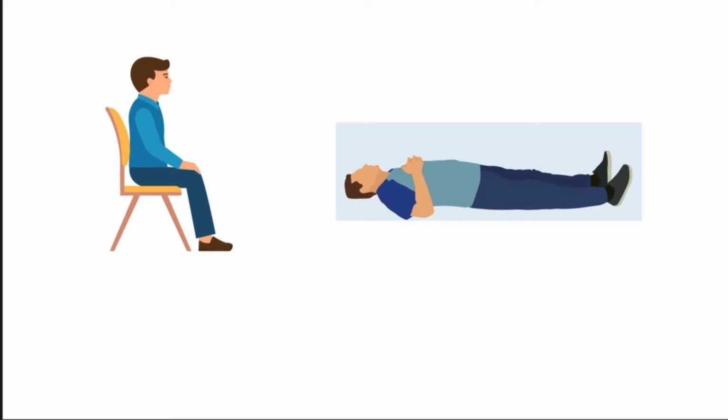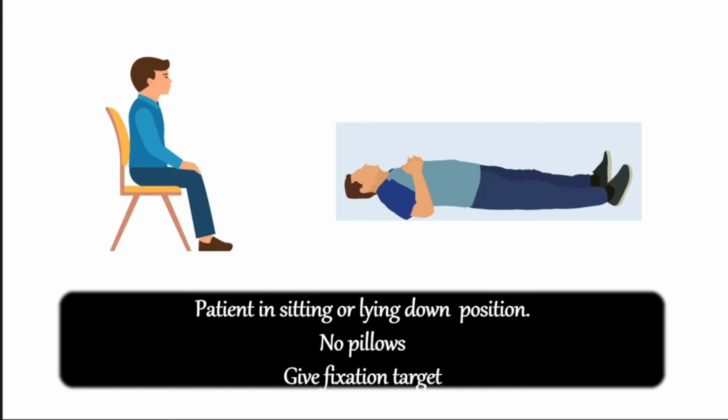Now over here, the patient could be sitting or lying down, but make sure that the plane of the iris is parallel to the floor. There should be no pillows or headrest below the patient. Always make sure that you give the fixation target to the patient.